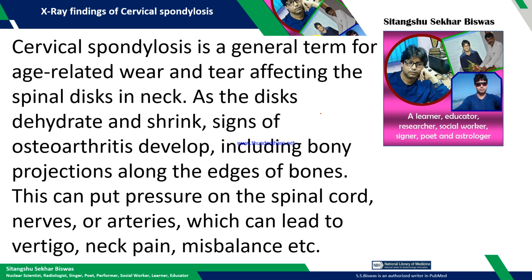Due to age it will develop, and this will also cause bony projections along the edges of the bones. It's osteophytes, we will see in the subsequent slides. This can put pressure on the spinal cord, nerves, or arteries, which can lead to cervical vertigo, neck pain, and imbalance. Sometimes it is during walking.